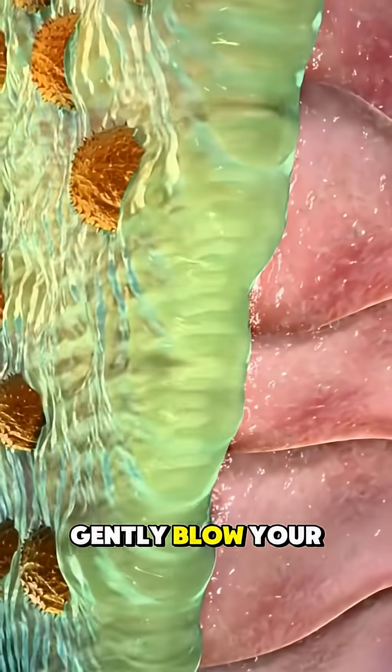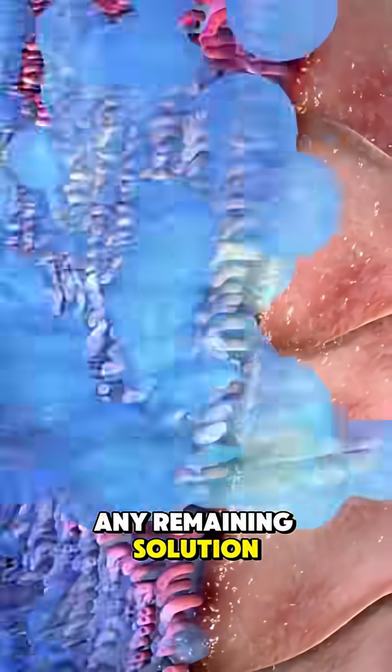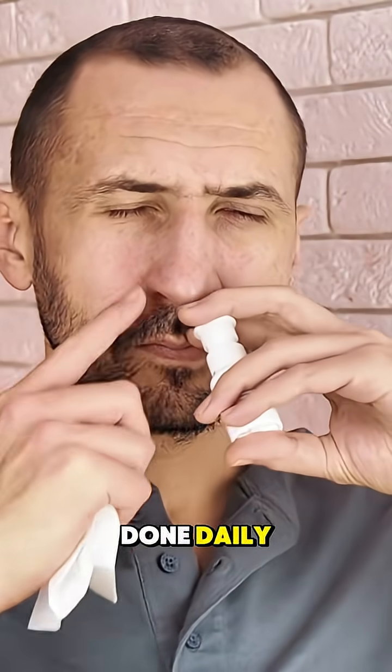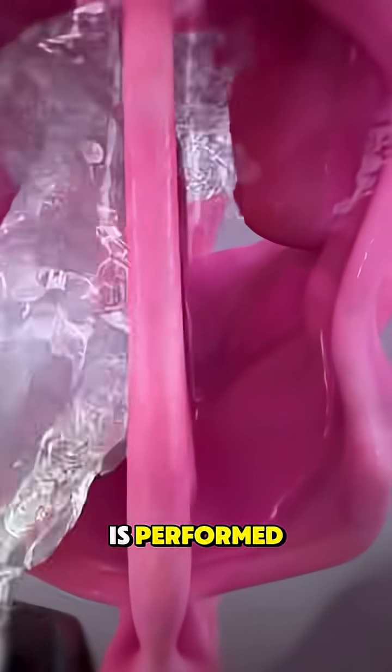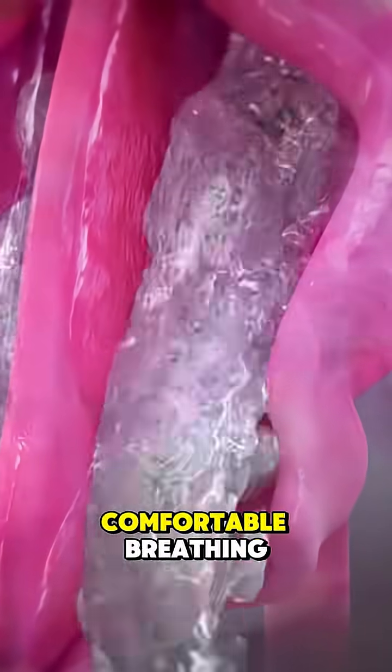Afterward, gently blow your nose to clear any remaining solution. Sinus rinses are safe, can be done daily, and provide fast relief from congestion and sinus pressure. And that's how a sinus rinse is performed — simple, soothing and effective for clear, comfortable breathing.